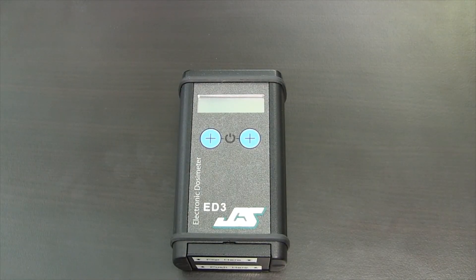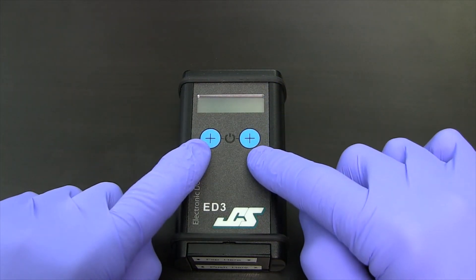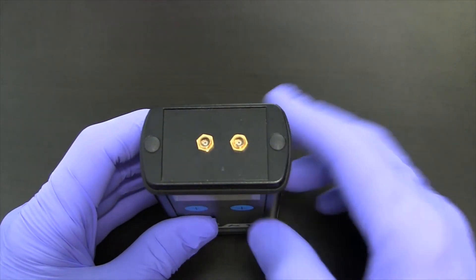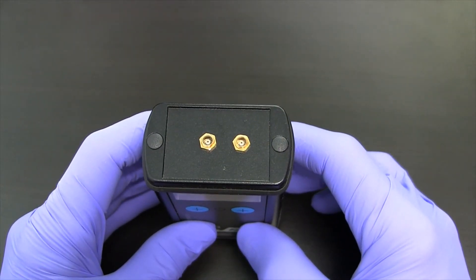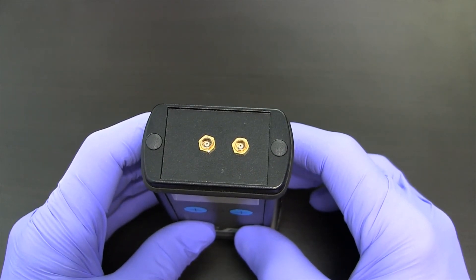This is the ED3 electronics unit. It has a display, two buttons that we'll discuss later, as well as two connectors for the two detectors, potentially one for each hand or for different extremity locations, although now optionally also for eye dosimetry.